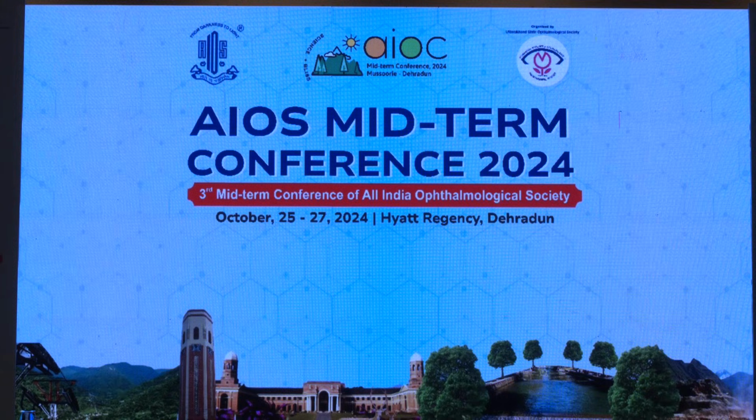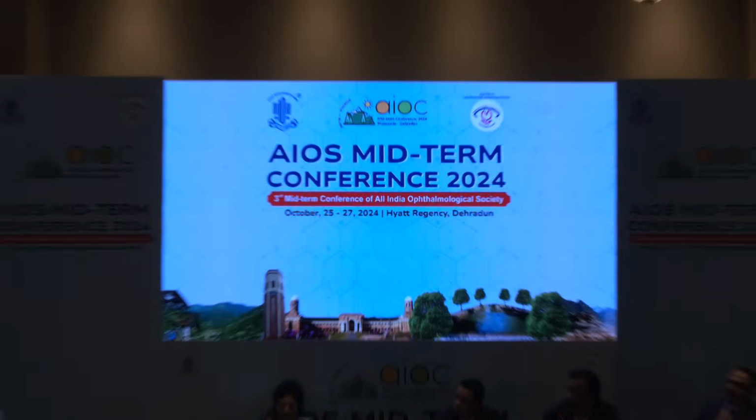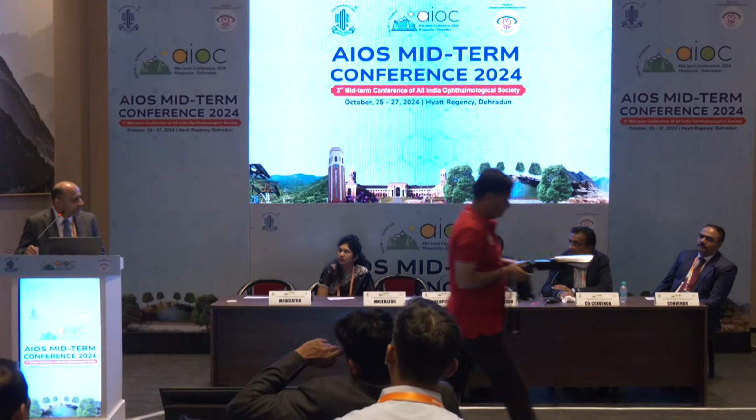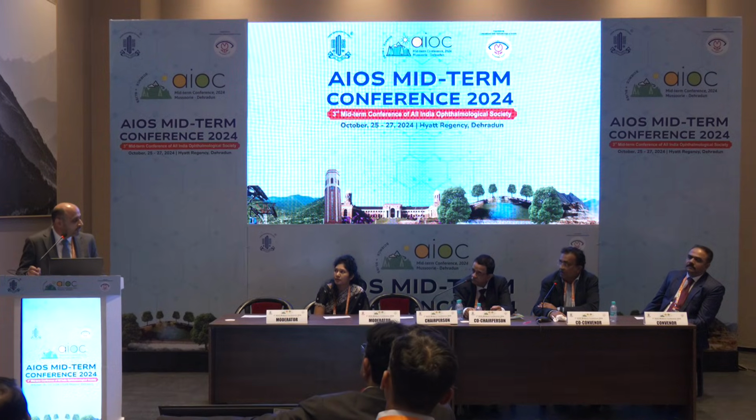Now we have 24 by 24. Plexelite gives us 24 by 24, so basically 24 mm by 24, and most commonly a 15 by 15. But with wide field, I think 15 by 15 is the maximum that would be with lesser artifacts. So roughly around 80 degrees is what we are going with OCTA.